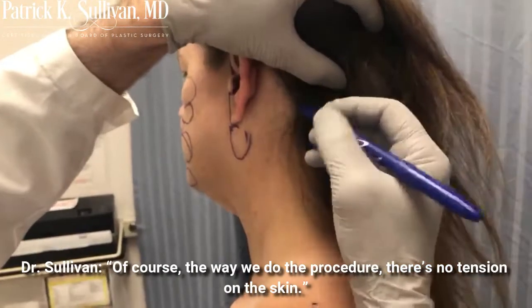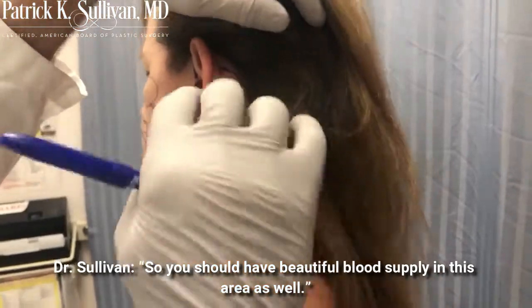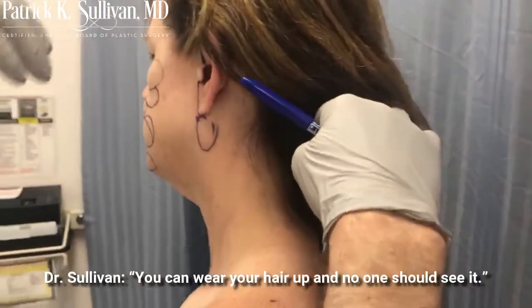Of course, the way that we did the procedure, there's no tension on the skin. So you should have beautiful blood supply in this area as well. Wear your hair up and no one should see it.